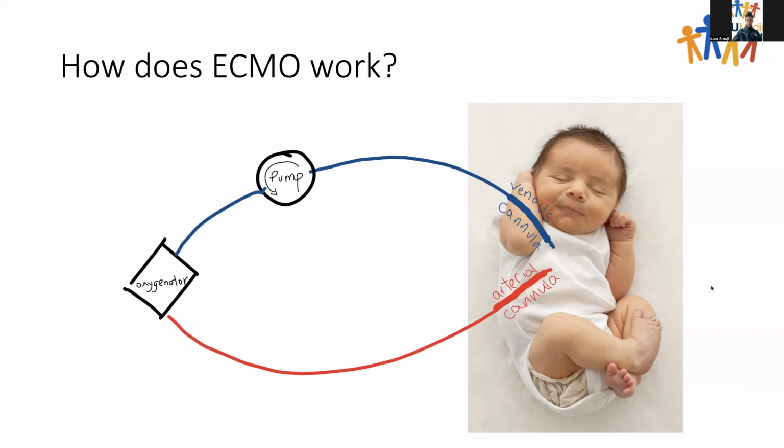This is the oxygenator. It is a hollow fiber membrane. O2 and gas go in fibers like alveoli and the blood flows around it. This is where gas exchange and thus oxygenation happens by diffusion.